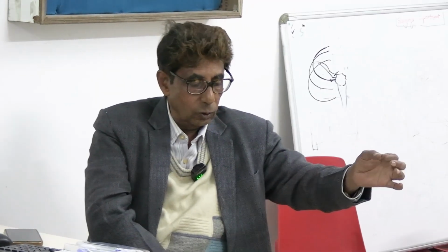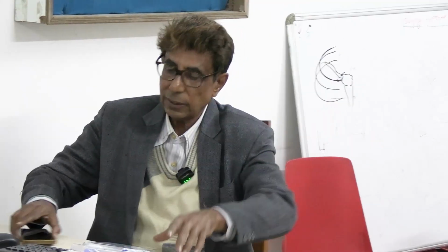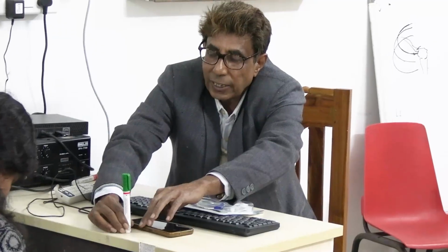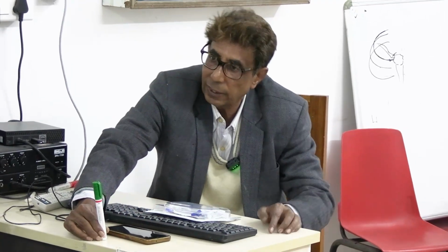There is a rod where you fix the transducer, and the patient is lying in the bed. This is the patient, this is the chest, and this is a rod where you fix the transducer. The fluid feed column we connect here, and the cable connects here, and that is with the monitor. You keep the transducer at the level of the patient's right atrium, in the fourth intercostal space. Okay, understand? Anything?